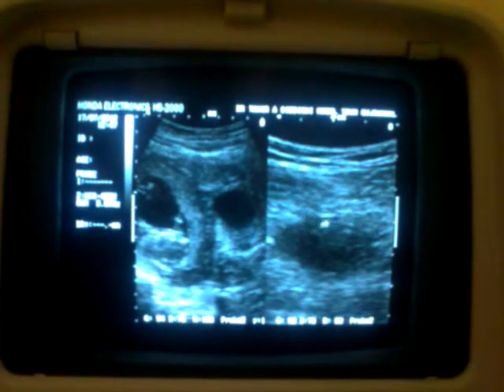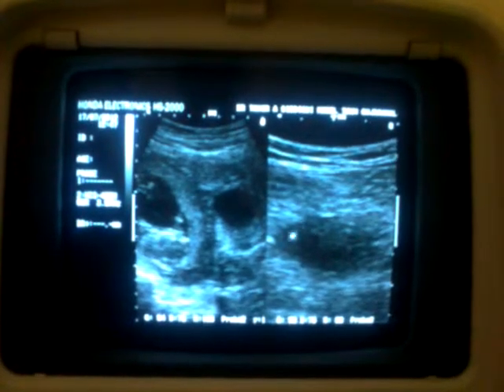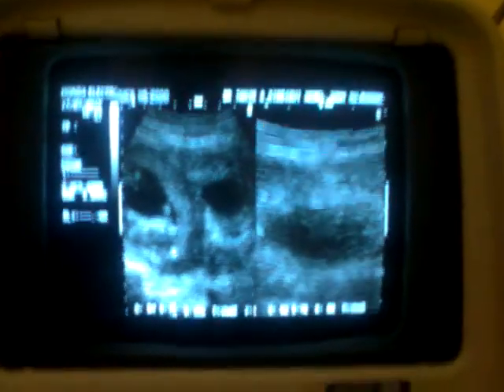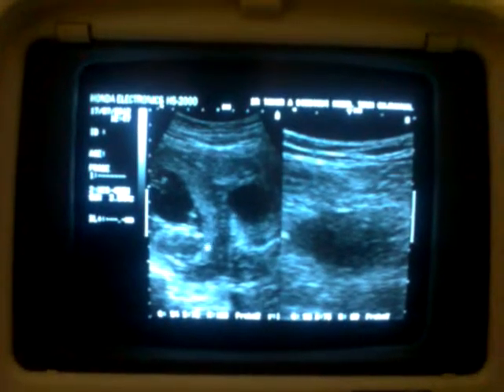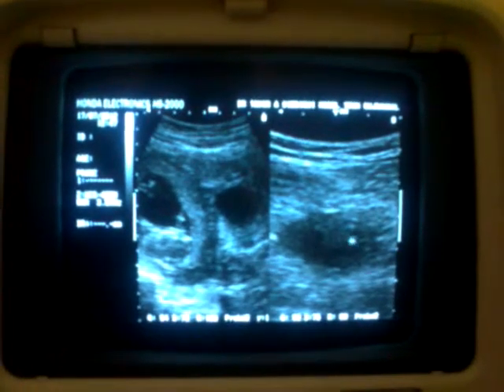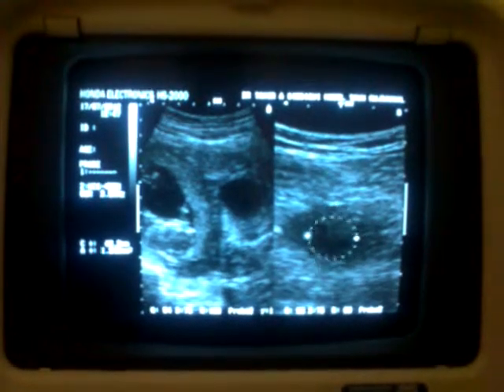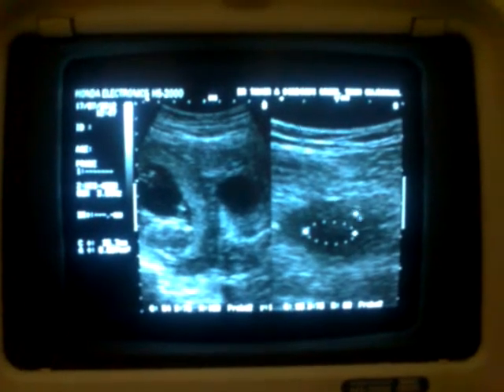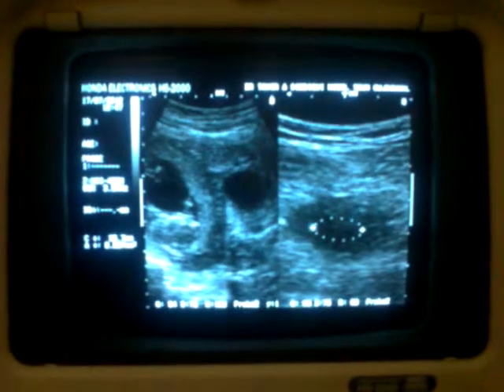So this is the third sac, with a broken echogenic ring. It is not, see this double decidual reaction, even echogenic of the same thickness, same echogenicity. But in this case, this internal area is the sac, and this is the broken ring, and the sac is irregular in outline, deformed, decayed.